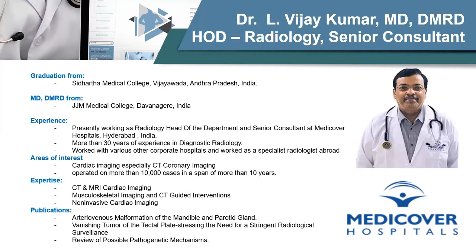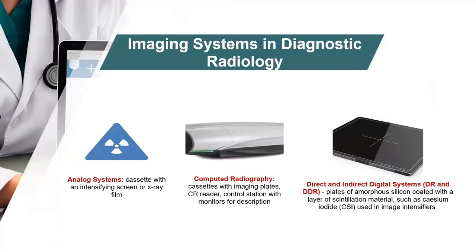Good afternoon to all the viewers. Thank you, CareStream, for giving me such an opportunity to speak to such a large platform, viewed by so many countries, so many viewers. So today, my topic has been given as progress from an older system, analog to CR to digital radiography. So I'll speak briefly about these features, and then step by step I go.